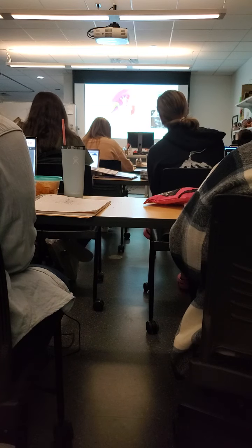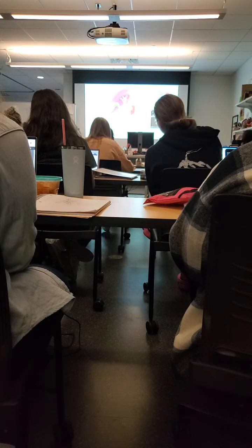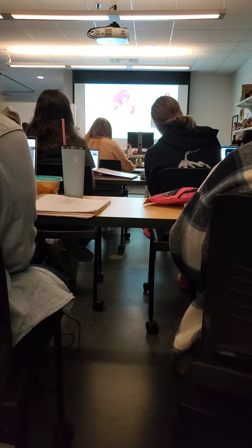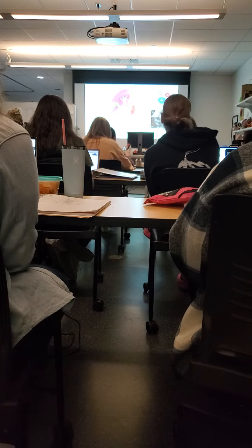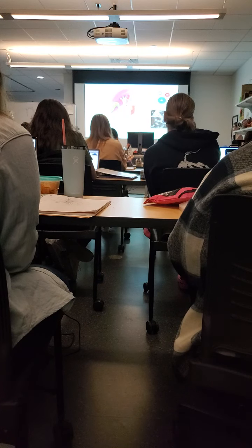So the portal triad consists of your main portal vein, your hepatic artery, and the common hepatic, bile duct, by the way, the CBD. Common bile duct, portal vein, hepatic artery. As you can see on this image right here, it's color coded for you. So this is a transverse, because we're cutting it transversely, right?